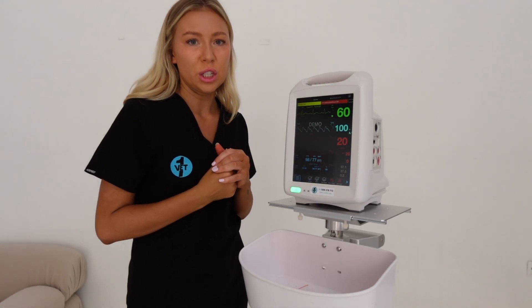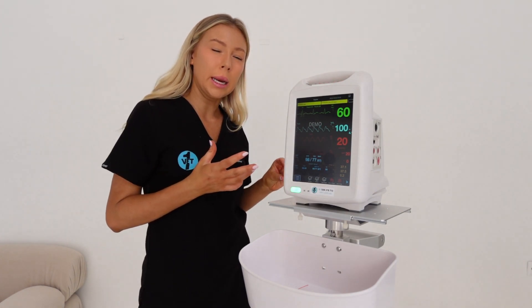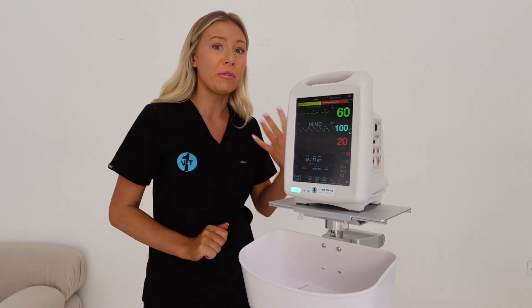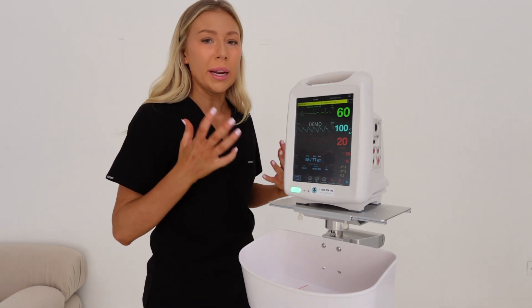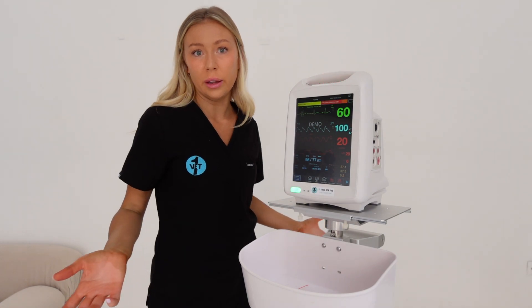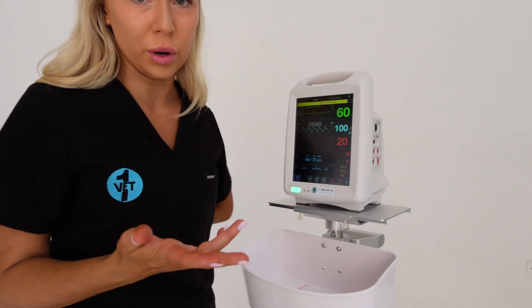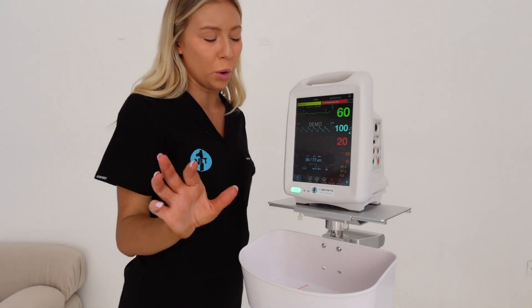We test all these machines on a simulator before they go out to clinic, checking that every single component is working accurately. If it was to pick up a fault or an unusual reading, we need to know before sending it out, because it's monitoring a patient while they're under anesthetic or in a critical condition, so it needs to be spot on - which we are very thorough about.